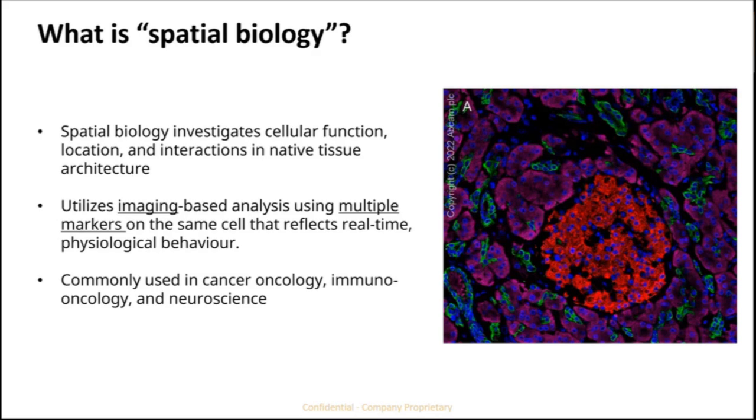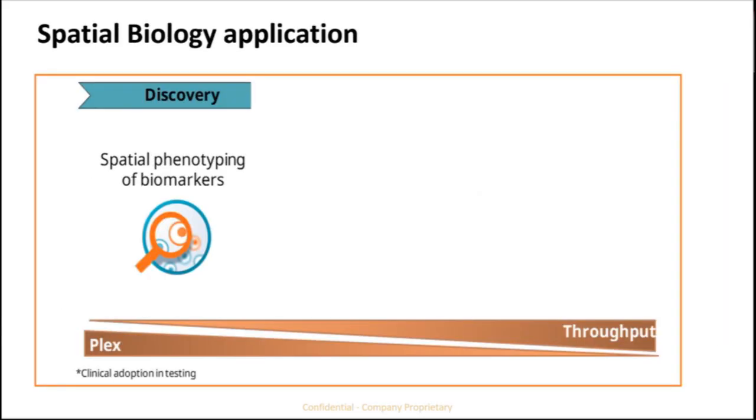In cancer research, this allows for deep dissection of the tumor microenvironment, precisely mapping the infiltration patterns of a range of immune cell subsets and their proximity to cancer cells. It is also frequently used in discovery with the hopes of bringing precision medicine to clinical use.